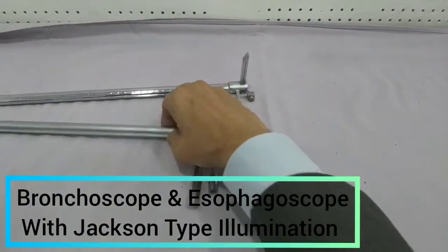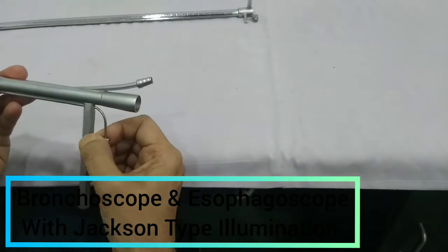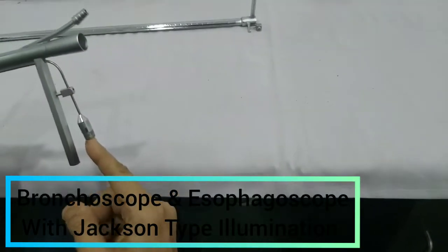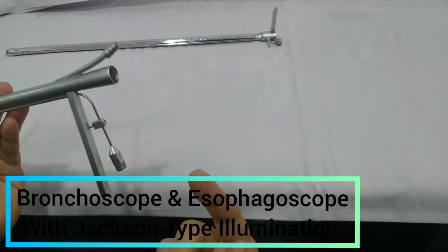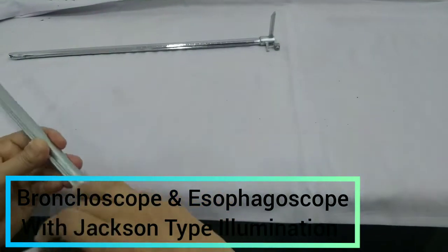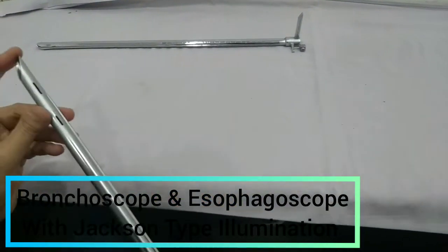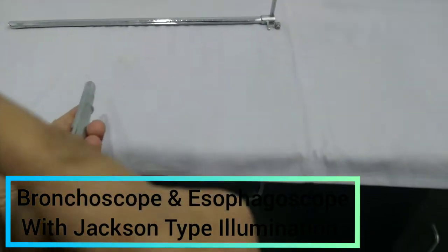Similarly, this is the bronchoscope. This is the light carrier, and this will attach to the flexible fiber optic cable, which is attached to the light source. Again, this handle will show us the tip of the bevel edge. So it will be introduced like this.